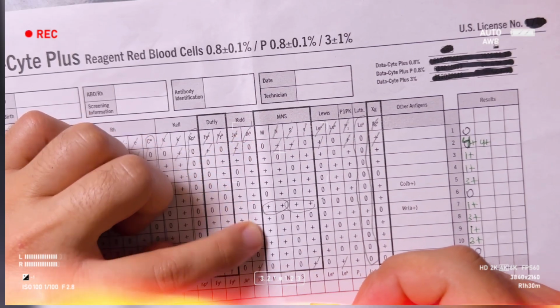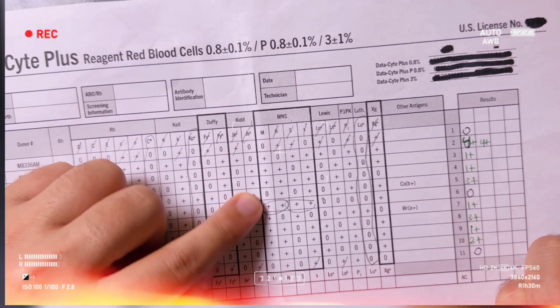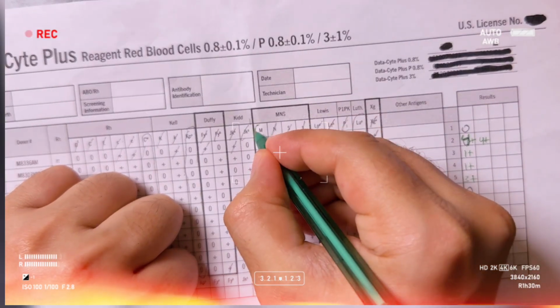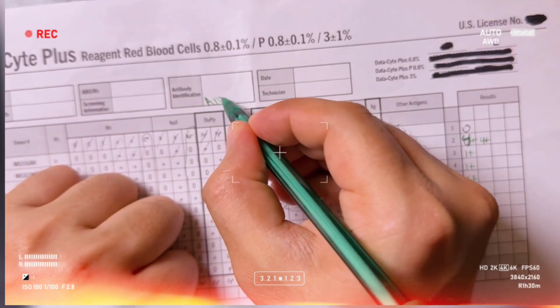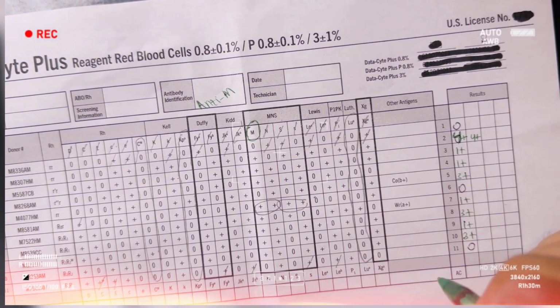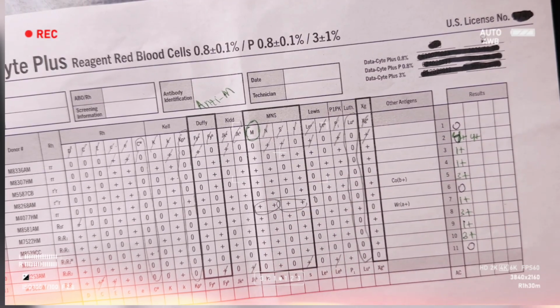So our antibody is anti-M in this particular patient, because we don't have a homozygous for the big M, and we don't have 2 heterozygous to rule out the M. So we have to give M antigen negative blood to this patient to make sure the transfusion is safe and the patient's immune system does not produce specific antibodies against the antigen we are transfusing.